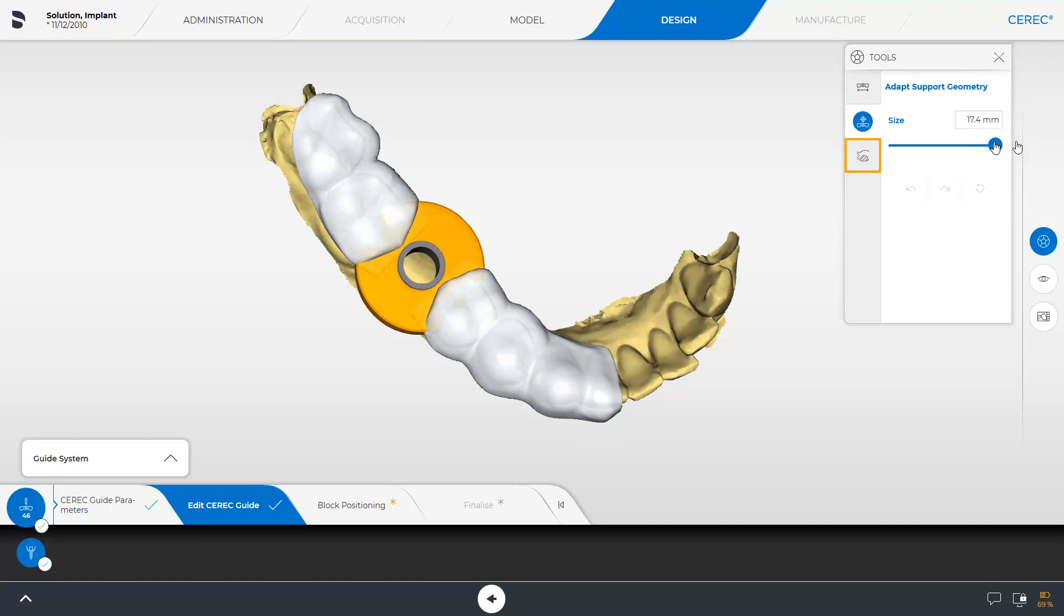The last tool in this step allows you to place inspection windows. To begin with, we place two windows proximal to the surgical guide sleeve, respectively.